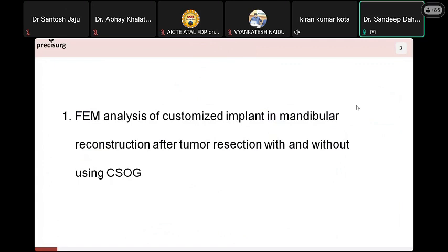By taking the dimensions from the X-ray, we developed this implant. Then on the manufacturing side, using the RP model as a pattern, we performed investment casting using SS316L material, then sandblasting, burr smoothing and rubber wheel cone polish, and then finally used this implant in surgery.